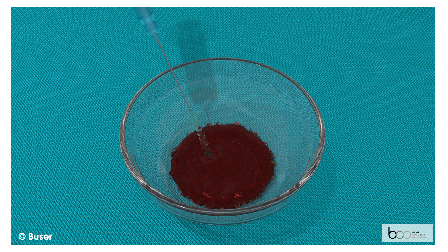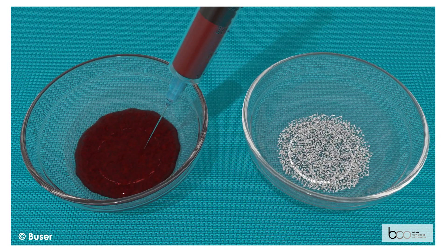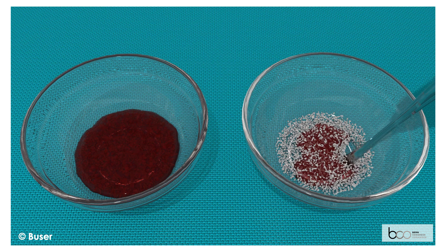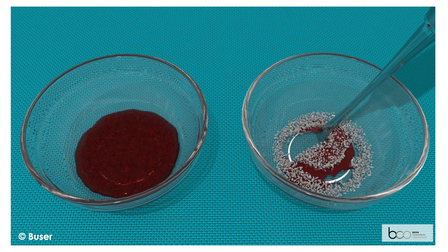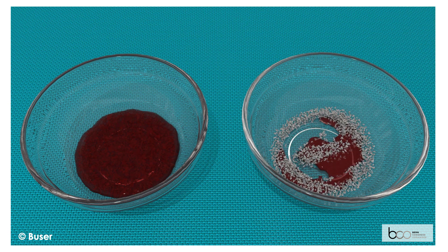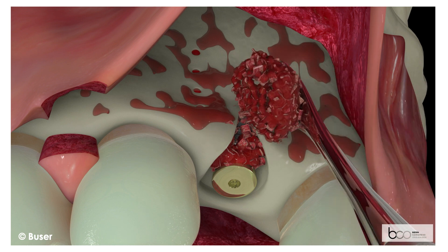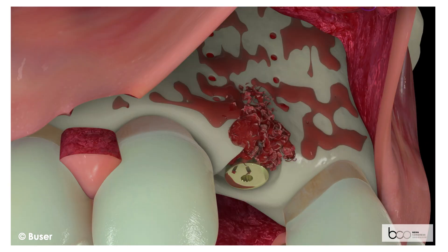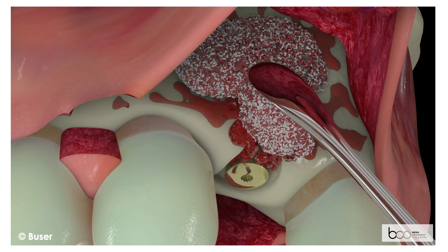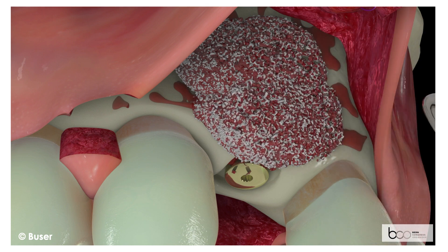The blood in the sterile dish is diluted with sterile saline to increase the volume of the bone-conditioned medium. This medium is used to moisten the bovine bone filler, which has a low substitution rate. The bone-conditioned medium contains numerous proteins and growth factors which are absorbed by the bone filler particles. Bone augmentation is initiated with application of the autologous bone chips: the first layer fills the rim of the healing cap and completely fills the facial bone defect, while the second layer of bovine bone particles is used to over-contour the local ridge anatomy. This surgical technique is called contour augmentation, using the two synergistic bone fillers of autologous bone chips and bovine bone particles.